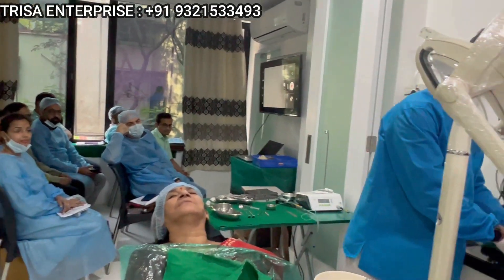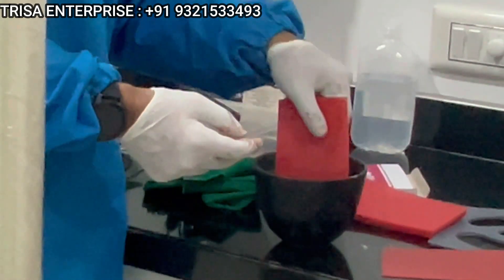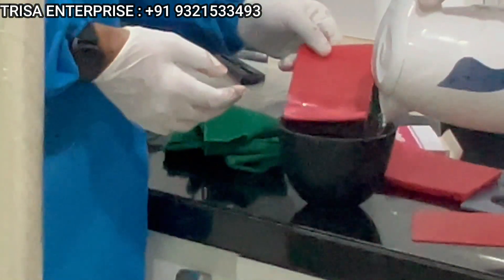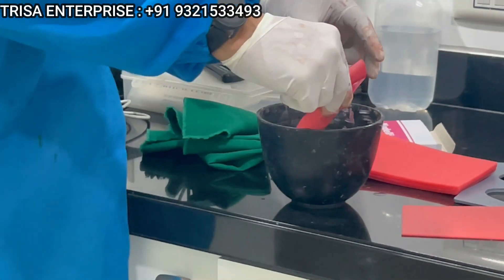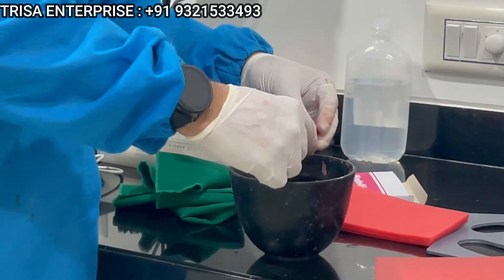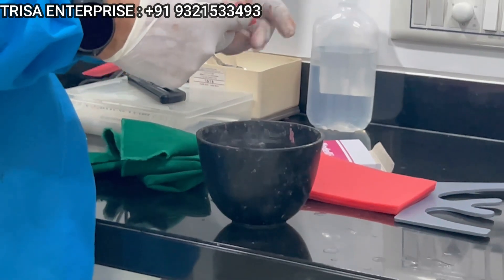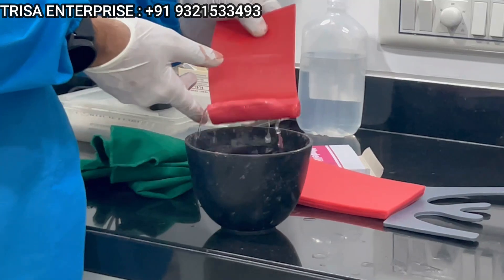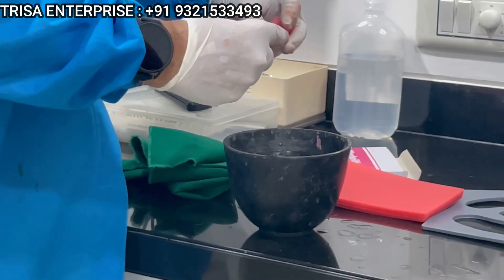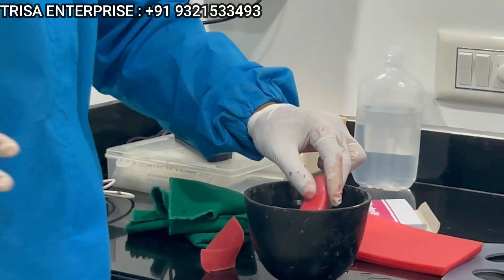This is the hot water — we are just going to temper some modeling wax. I've taken one sheet of modeling wax and then over that I am rolling another sheet of modeling wax. Now here is the trick part: once you have these two sheets, you need to create a ring in the mouth. I'll show you exactly how to do it.